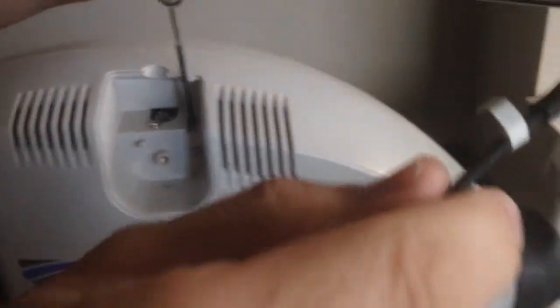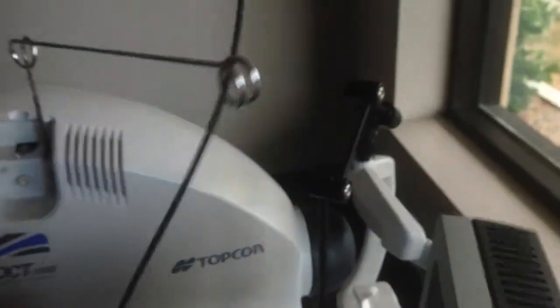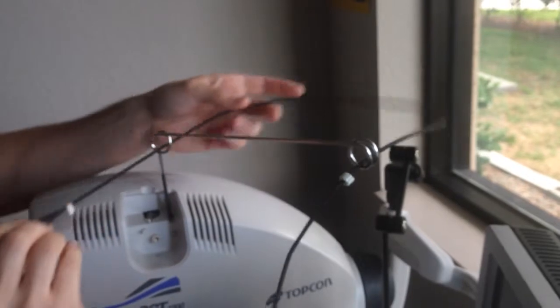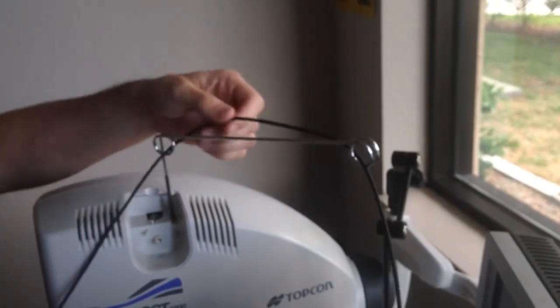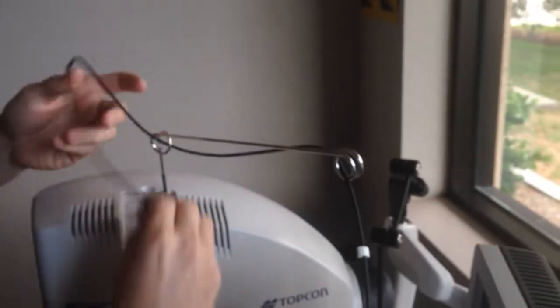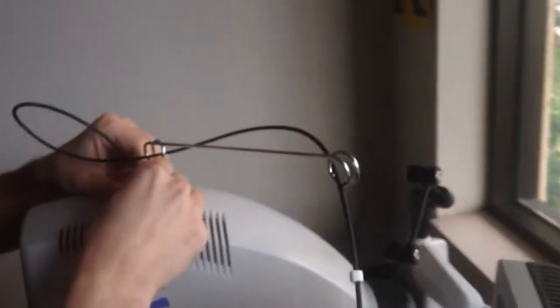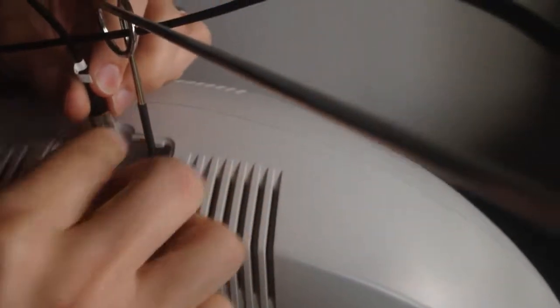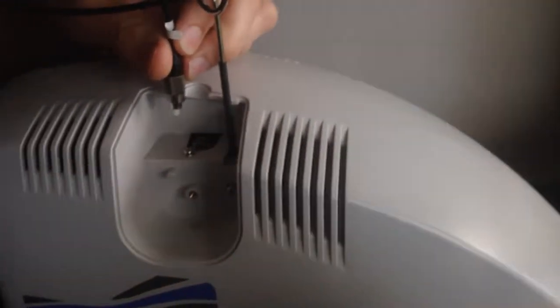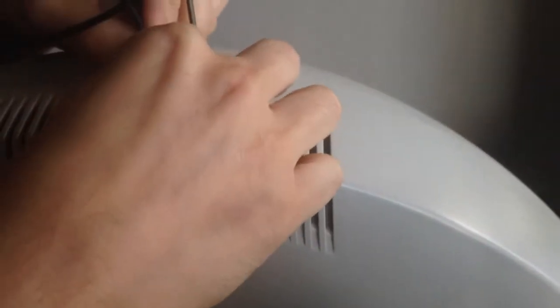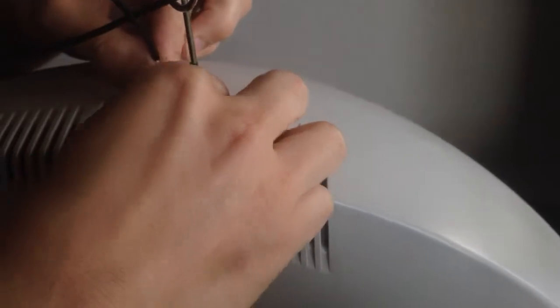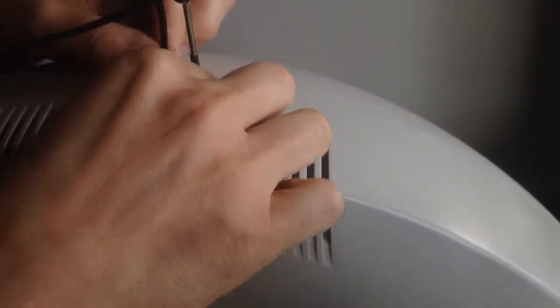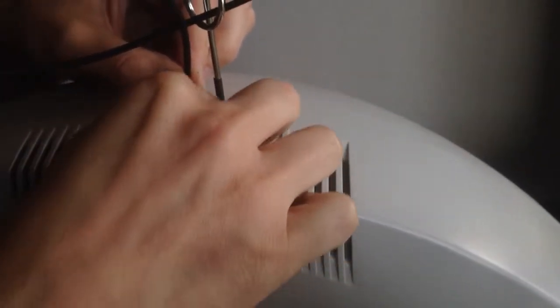I'm going to run the cable through here. Like this. And then just straight down into the OCT. Again, it's notched the same as the other one. Push it down in there. Screw it tight.